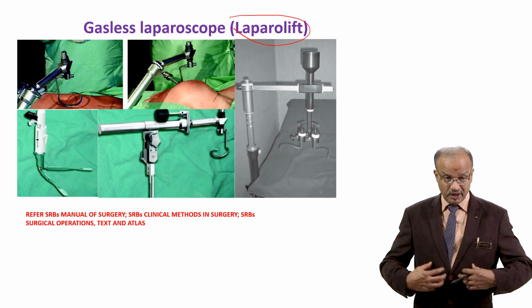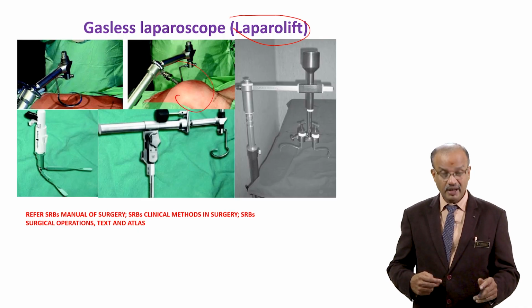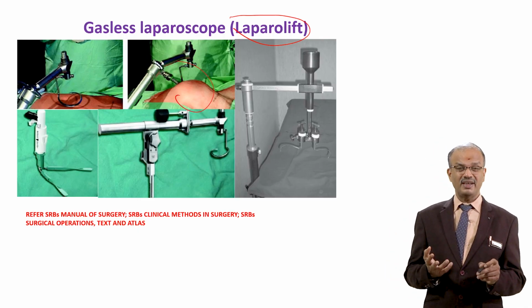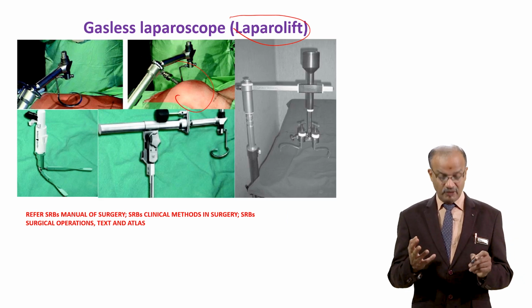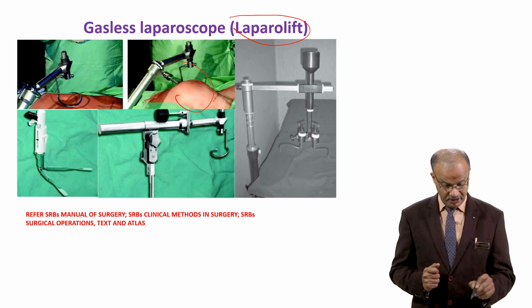So different instruments are there. Hold the abdomen like this, lift it. So they see how it is lifted. Then put ports, then do the surgery. Technically it's demanding and not very popular, but still people do this procedure. Remember, it's called laparo lift or gasless laparoscopy.